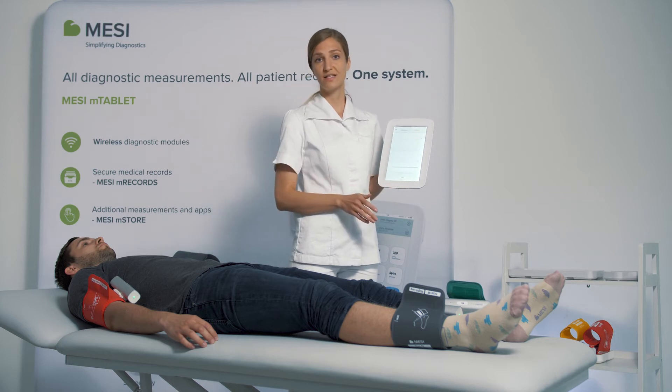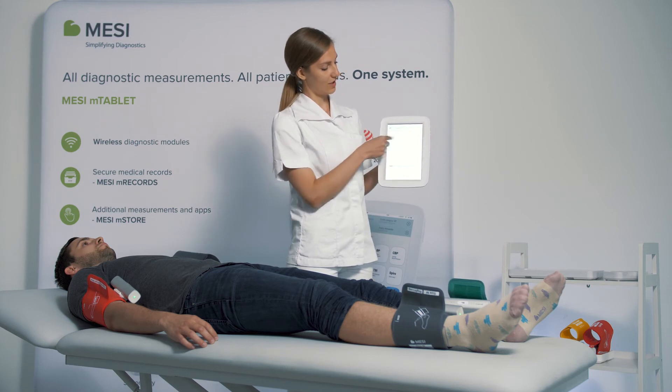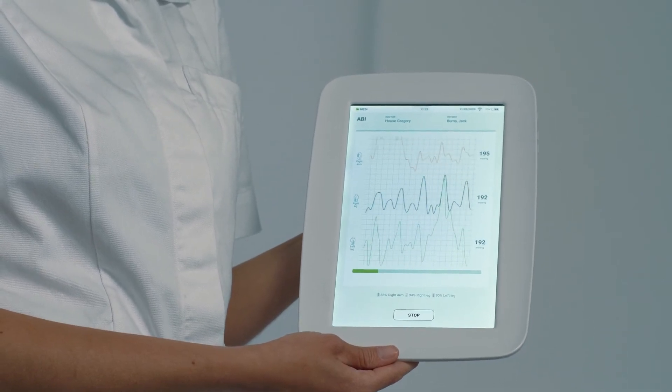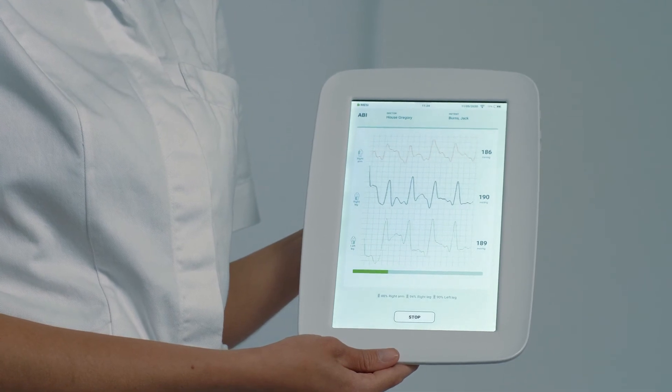The smart arm detection determines that the higher of the two arm blood pressures is the right arm. The colors of the graphs correspond with the color of the cuff. After a couple of seconds, the pressures level out and we can monitor the pulse waveforms throughout the entire measurement.